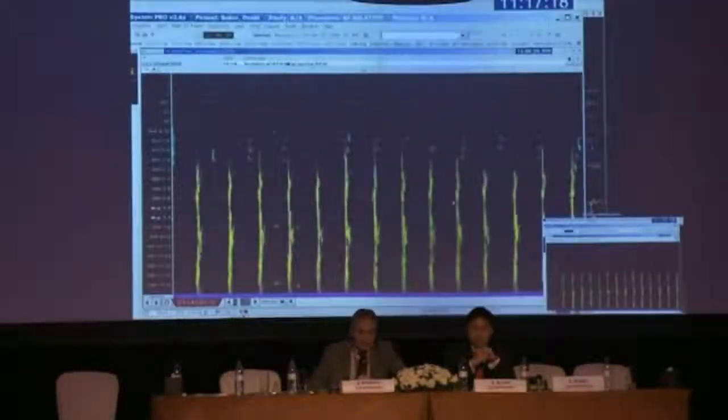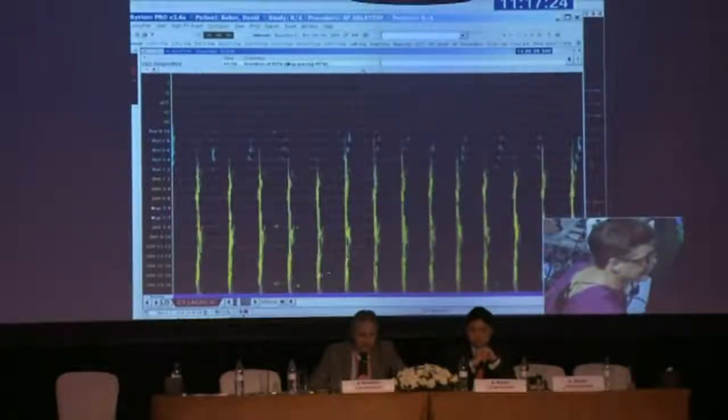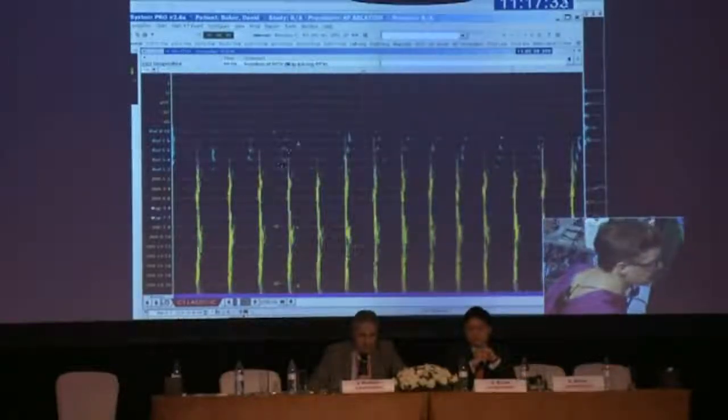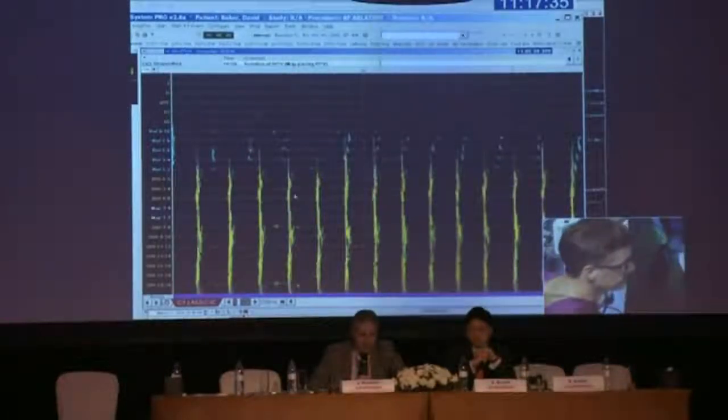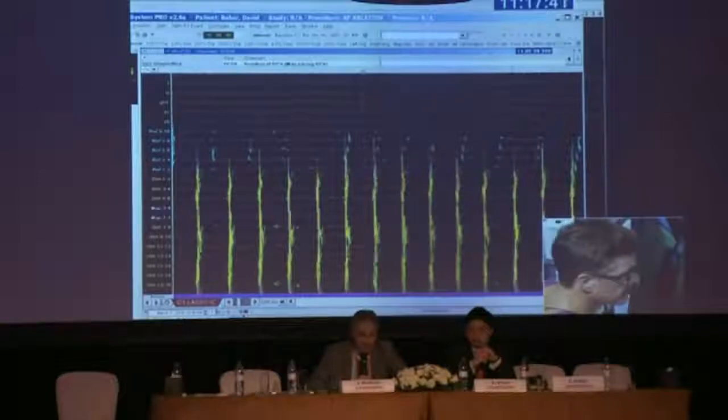Thank you. So here you can see that it's clearly random, it's clearly irregular, but there is a pattern. Although the proximal does become earlier than distal occasionally, in the CS it's generally distal to proximal. Generally the PV is faster than the CS, suggesting that whatever is driving the AF is closer to the PV.